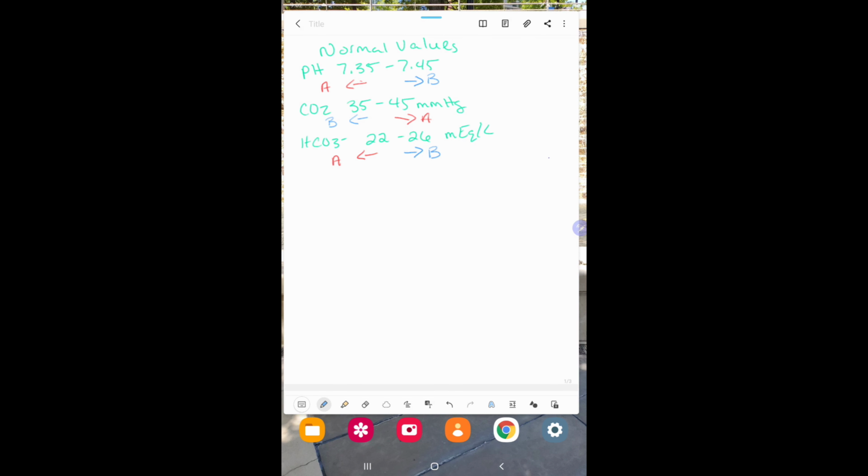Okay? Now, I showed you in different colors so that it's easier to see. But if you look at the lower end values, you notice an ABA pattern. This is something that I picked up on. As long as I could write out my values and know that one side was ABA, I knew the other side was the opposite, meaning BAB. That was just something that I learned as a quick trick.